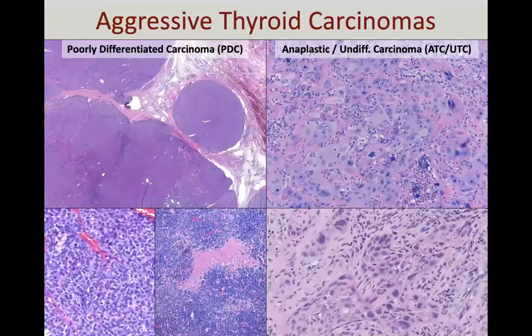And so you can have atypia of, what's the word I'm looking for? Like cyst wall atypia. Arguably though, when you start to have, without colloid, without other evidence of benign disease on FNA, lots of cells that have highly pleomorphic nuclei, maybe even mitoses, you may want to start thinking about one of the aggressive thyroid carcinomas like poorly differentiated or anaplastic / undifferentiated.